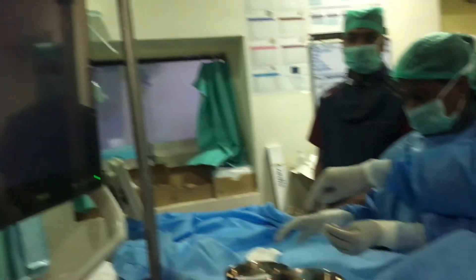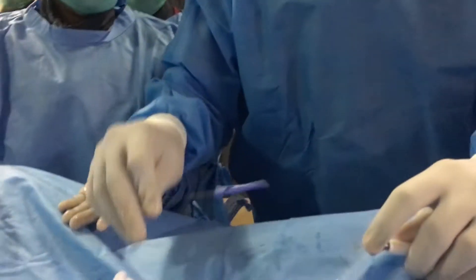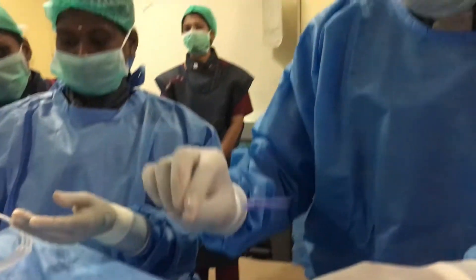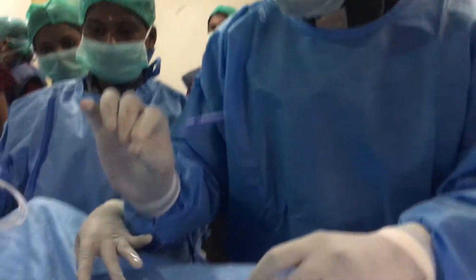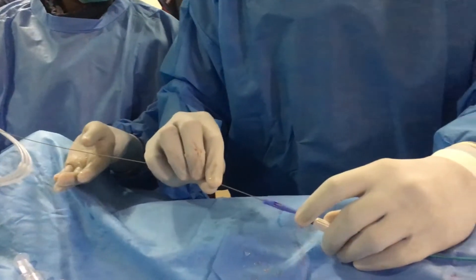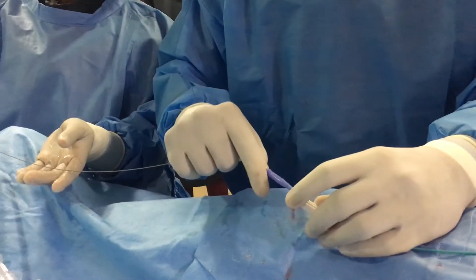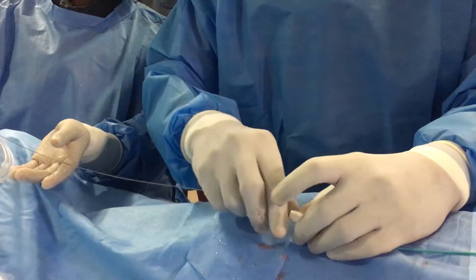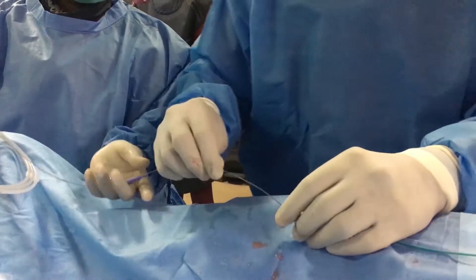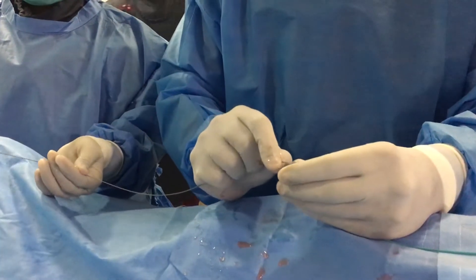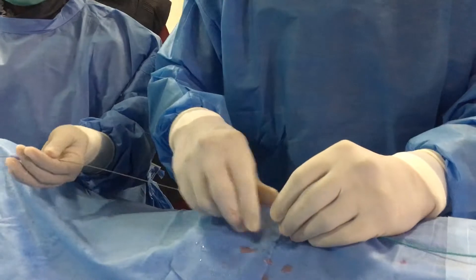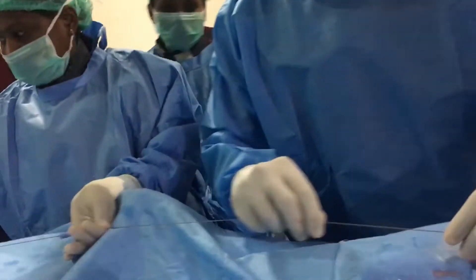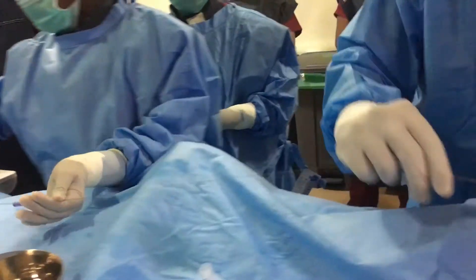So now we are going to use Amplatz ultra-stiff wire. This is not super stiff, this is ultra-stiff wire. Amplatz ultra-stiff exchange length wire. So 0.035 inch, because we have to track the Mullein sheath over this. So Mullein sheath will not track over our usual Terumo wire. So we need a stiffer wire. In case we are using ultra-stiff, any stiff wire should be fine.